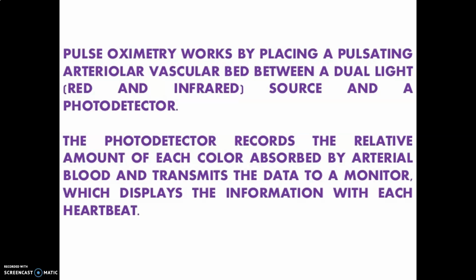So the photodetector records the relative amount of absorbed light, and the monitor displays the information for each heartbeat, how the patient is breathing, and with the help of that we are able to detect the pulse rate.